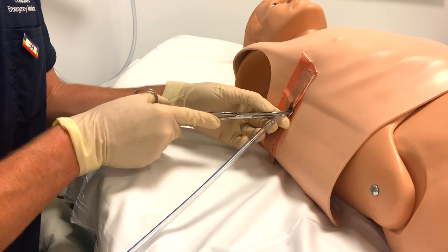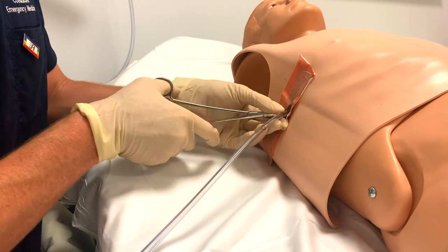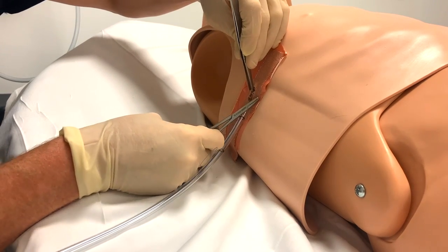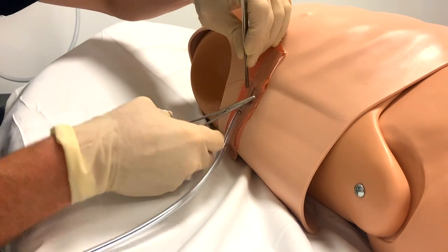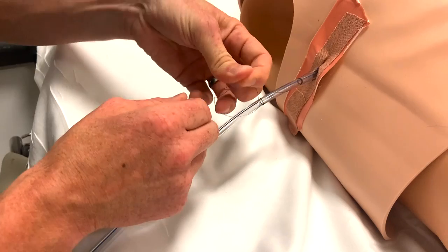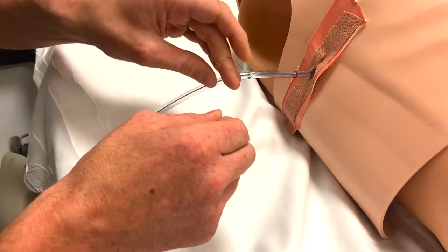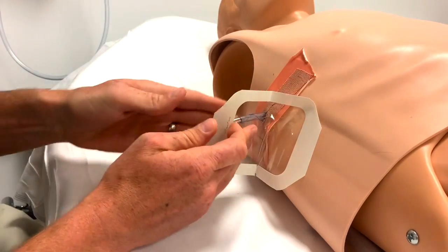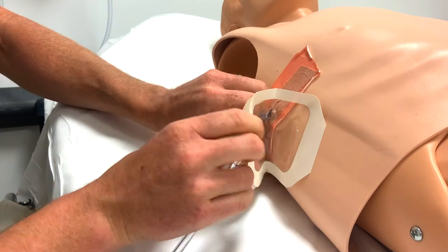Your last stage is a good stop. The drain doesn't have to go in very far — only as far as the four centimetre marking, which is four centimetres from the last side hole. Don't push it in any further as it will either cause trauma or just won't work. Once you've stopped, secure your tube in place with a simple knot, leave long ends on either side, wrap them lattice style around the drain, tie a simple knot at the top, repeat with a suture on the other side, then secure it all together with two Tegaderms opposing each other.